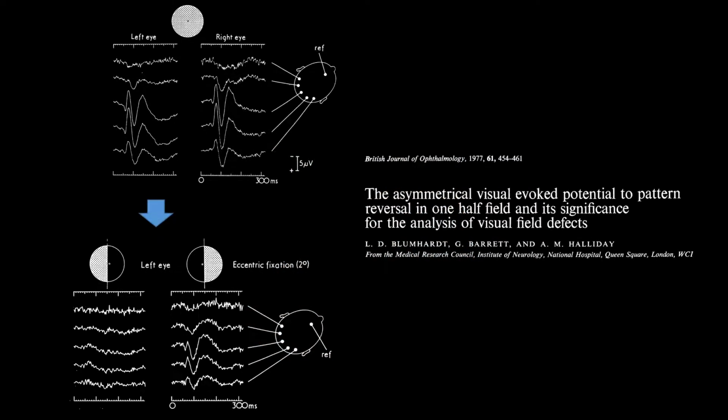Its role, other than for investigational purposes, is now restricted to confirming chiasmatic or post-chiasmatic pathology detected by full field visual field testing.